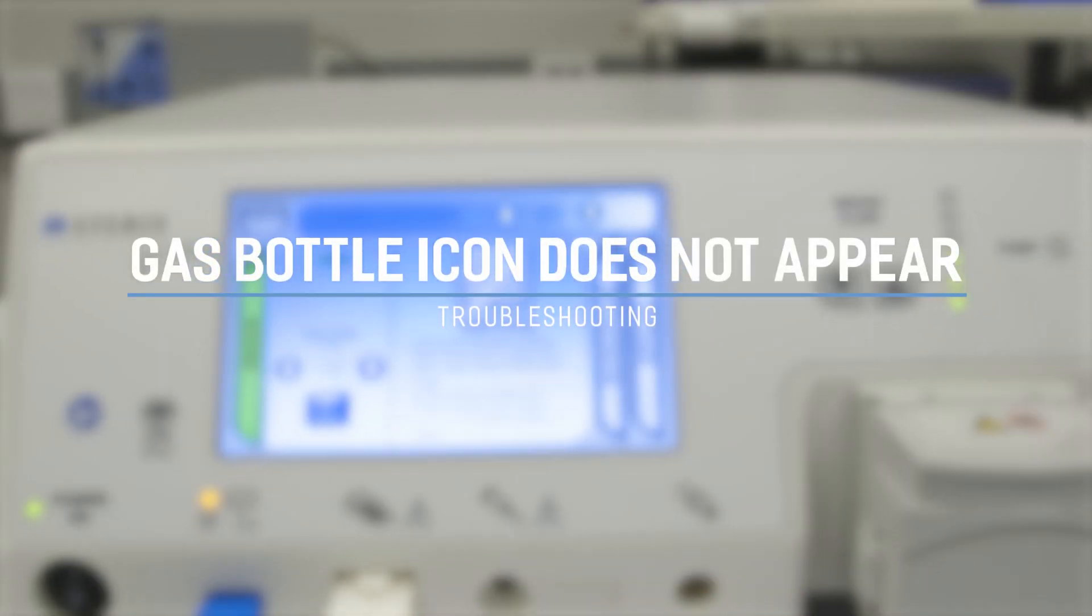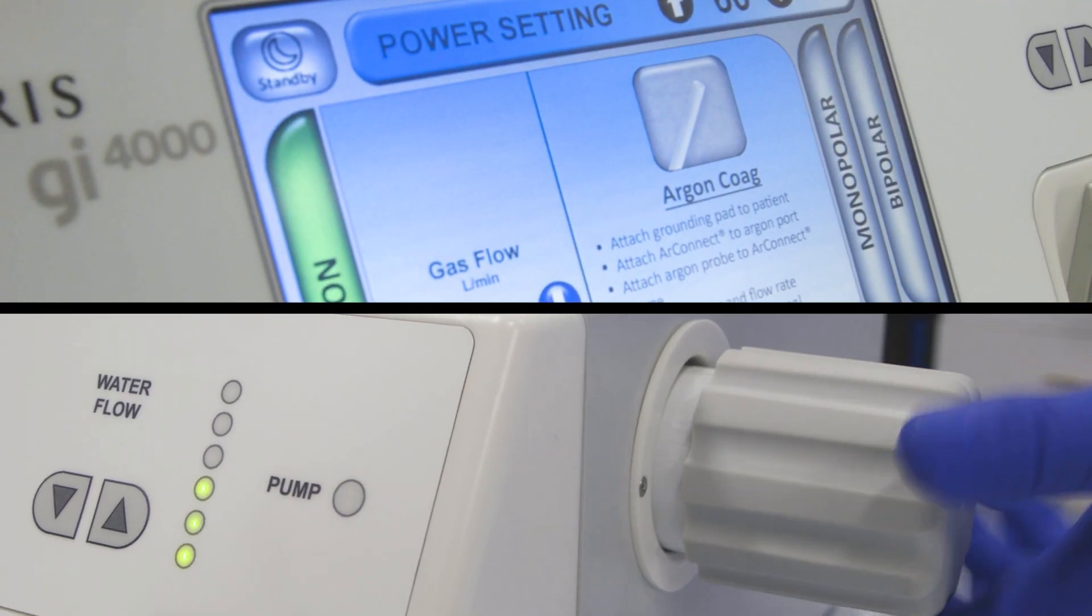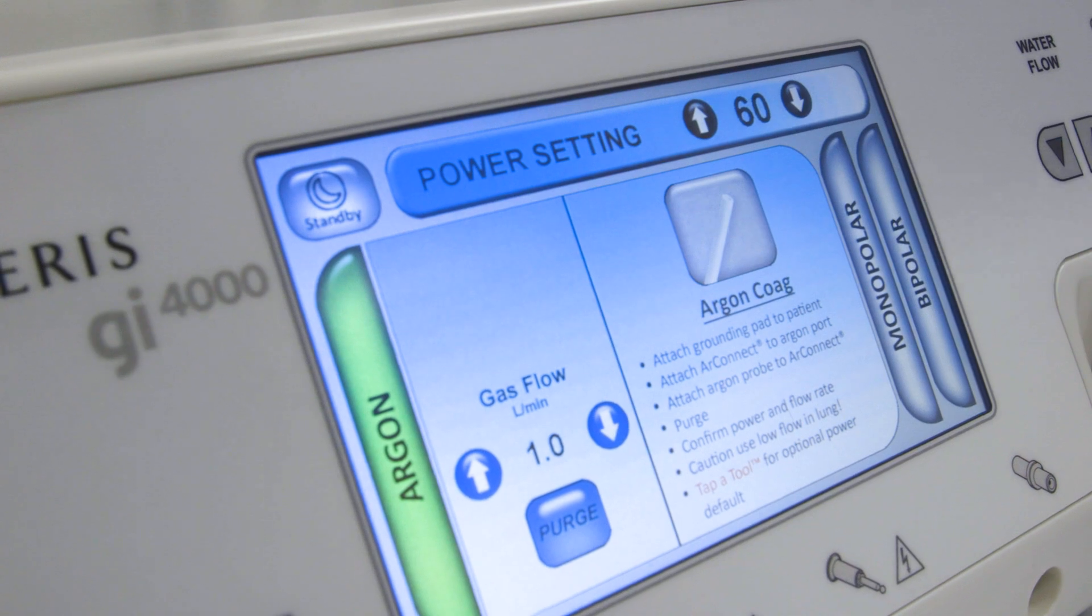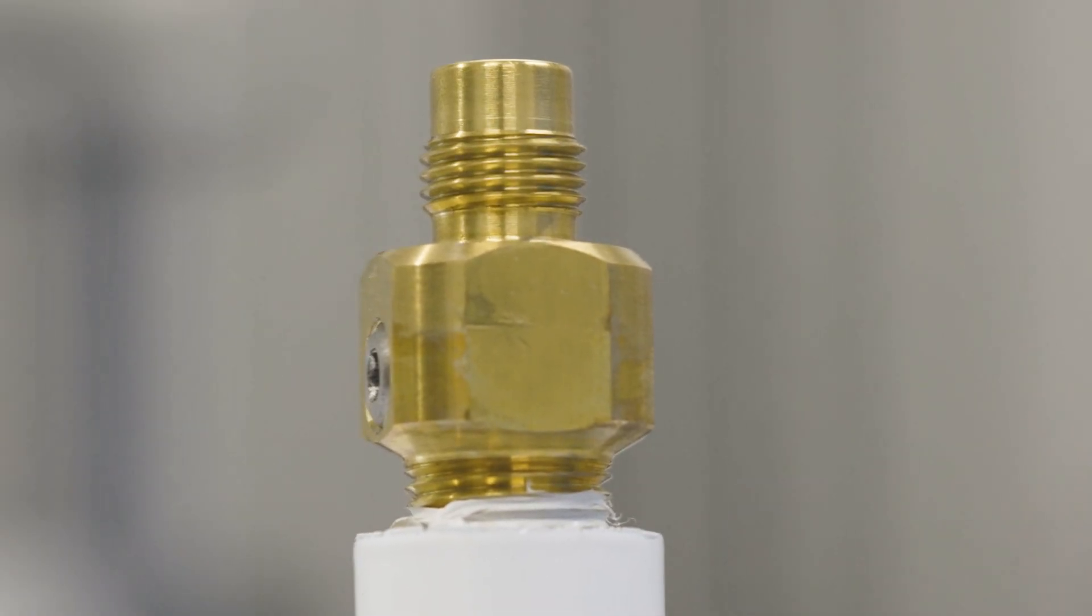Argon gas bottle icon does not appear. Continue turning the bottle clockwise until it is fully engaged. If the green gas bottle icon does not appear, inspect the brass threads for damage.